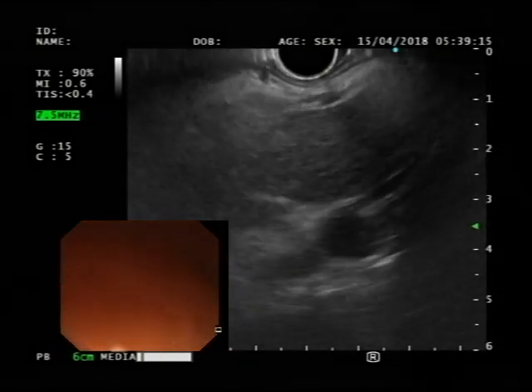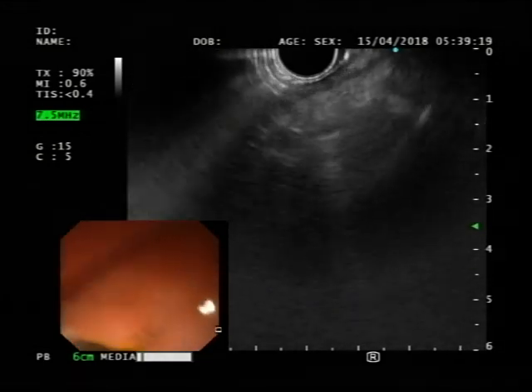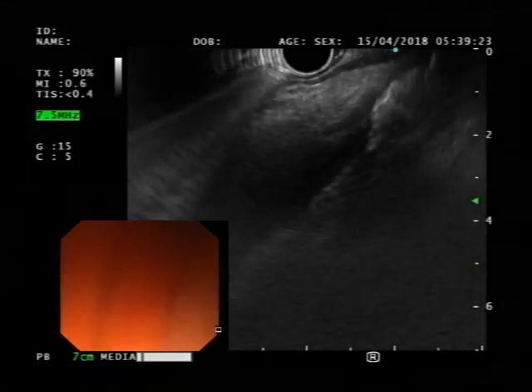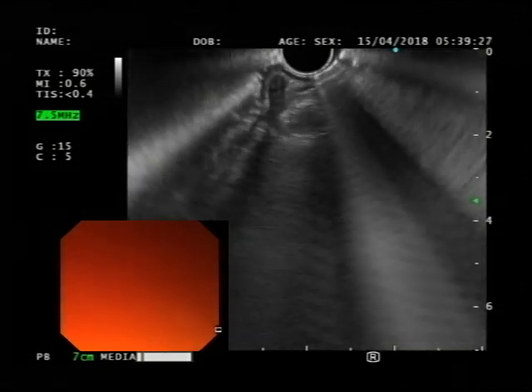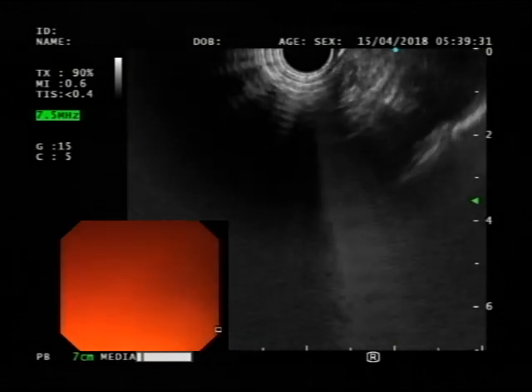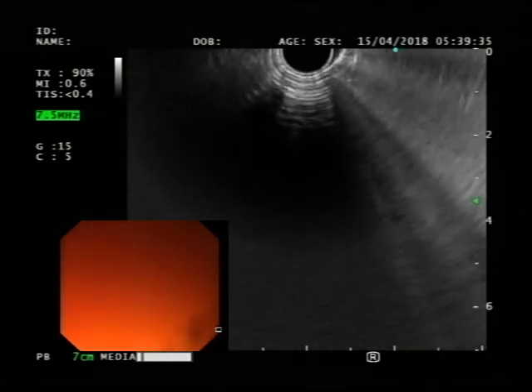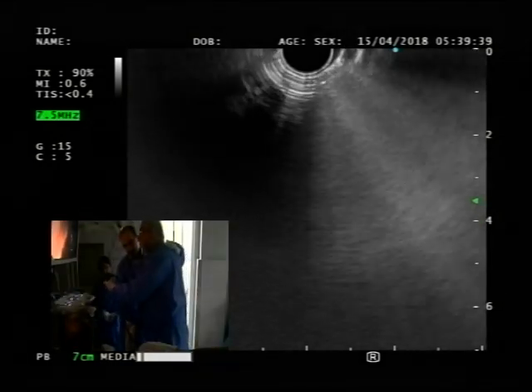Okay, so one good point, evaluate the liver. Make sure we look for mets. I mean, that changes her staging, of course. So once you're in the GE junction area, go clockwise. So yeah, and not from there. Here. There you go. That's it. And then this is just supporting. That's right, fine. And now go the other way.